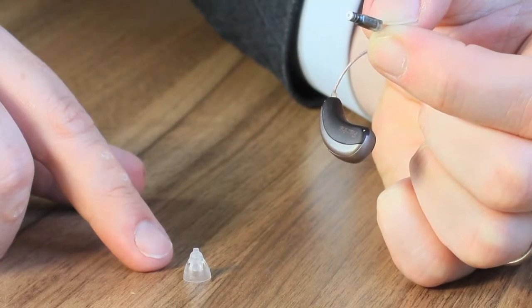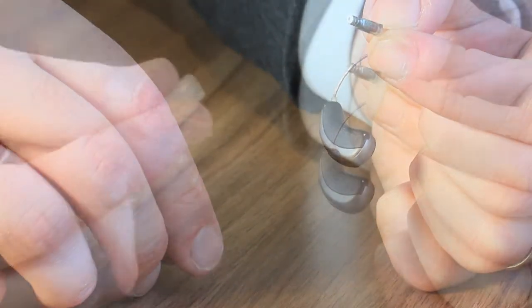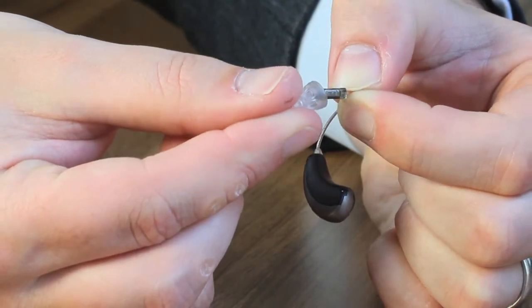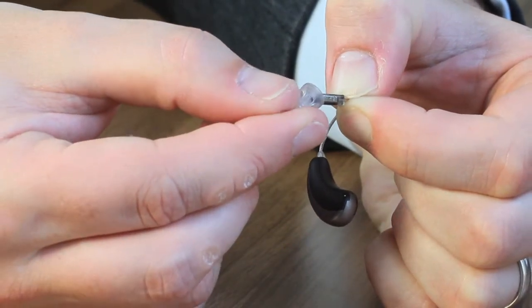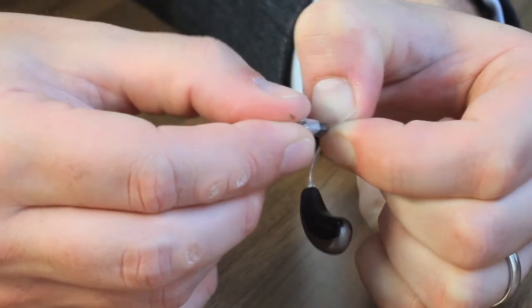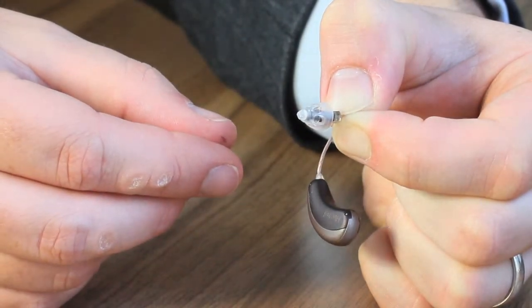Then you get the rubber dome, place it back over the receiver making sure that there is a high level of retention so that it's not going to come off in the ear.